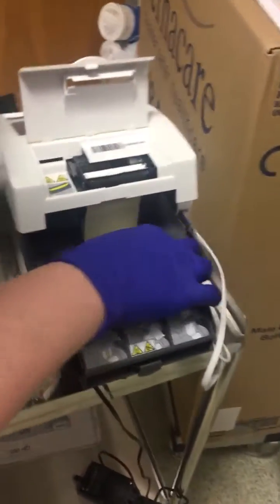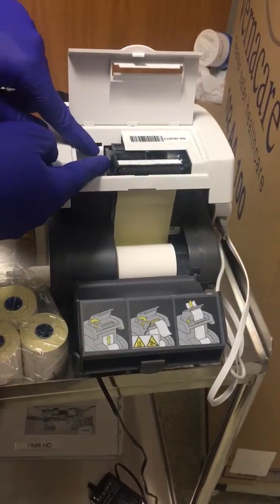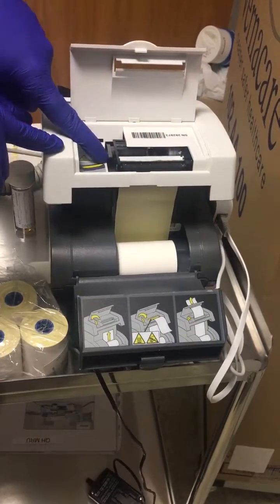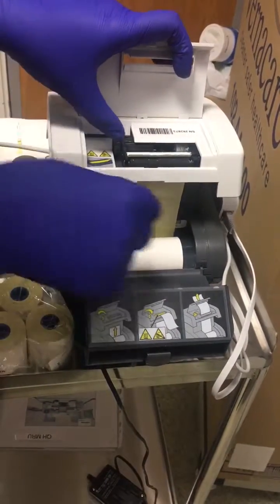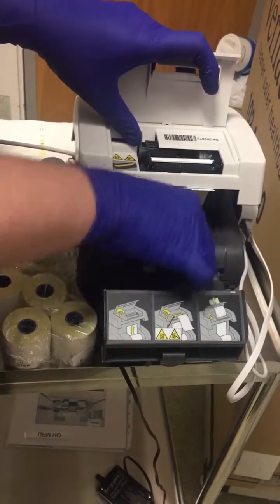The paper is rolled in towards the back, as you can see. There's also a little lever here — don't forget this lever. You need to release it, which allows you to get the paper fed through easier.